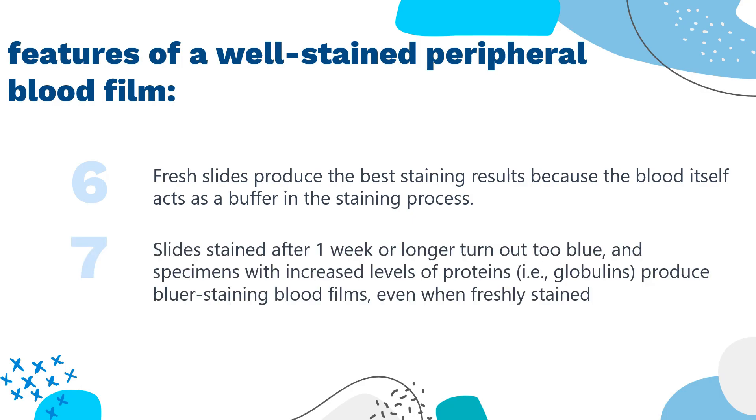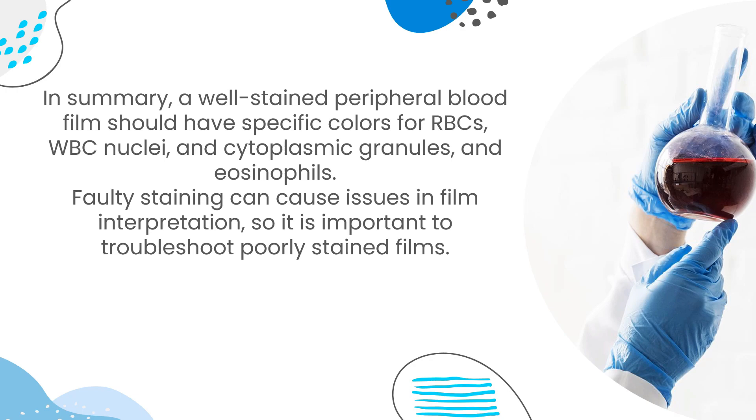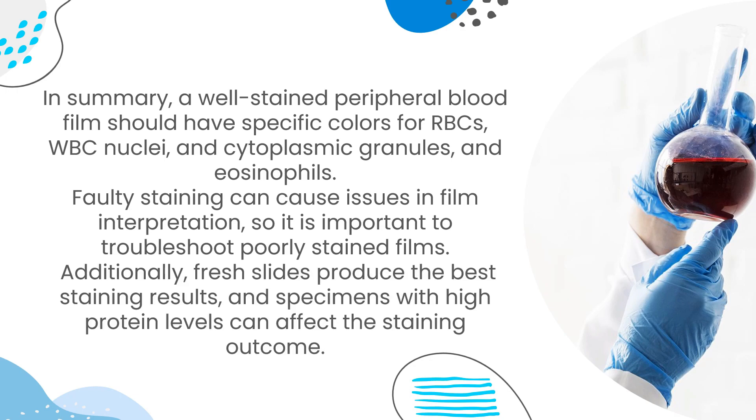Slides stained after one week or longer turn out too blue, and specimens with increased levels of proteins, such as globulins, produce bluer staining blood films even when freshly stained. In summary, a well-stained peripheral blood film should have specific colors for RBCs, WBC nuclei, cytoplasmic granules, and eosinophils. Faulty staining can cause issues in film interpretation, so it is important to troubleshoot poorly stained films. Fresh slides produce the best staining results, and specimens with high protein levels can affect the staining outcome.